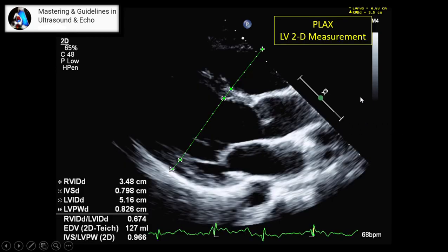If for any reason we cannot get a good M-mode on the left ventricle, we have to do the measurement in 2D. For 2D measurement, we do it at two different times, end-diastolic and systolic. For end-diastolic, we go into cine loop and at the level of the Q or R, wherever it gives clear endocardium at the two valves and has the largest LVID. Then our measurement line should be perpendicular to the IVS, posterior wall, and left ventricular axis.